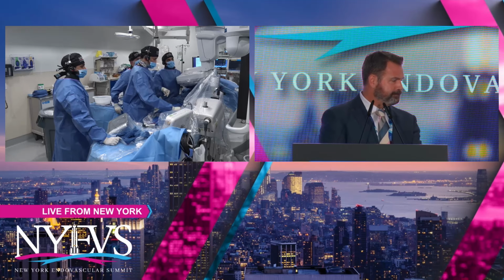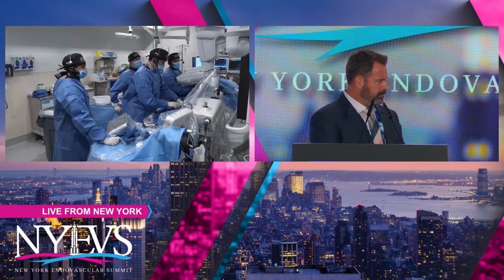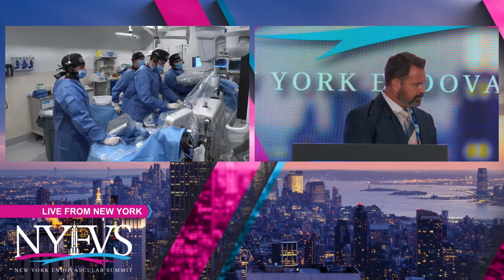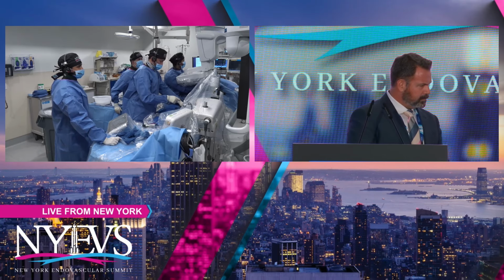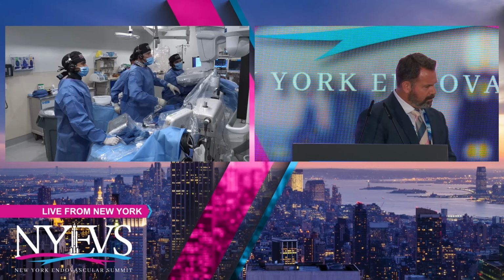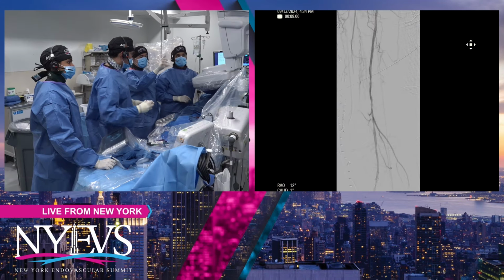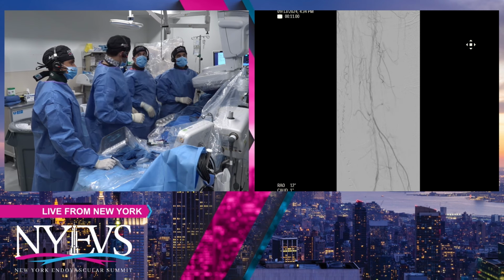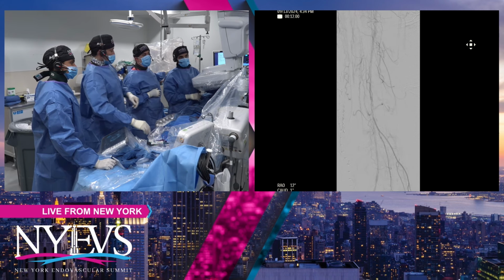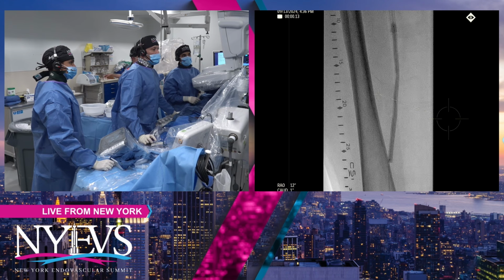Because we had not touched the real distal edge where the new lesion was, we prepped it with a 5-0 balloon. The size was 4.4 to 4.7 distally. Then we decided to do the DCB of the whole segment, distally with the 5-0 long DCB, and proximally. This is purely after the prep of the lesion distally. Now you can see inline straight flow going down faster than your collaterals, which is a good sign. The filter is open and all the other branches are open.